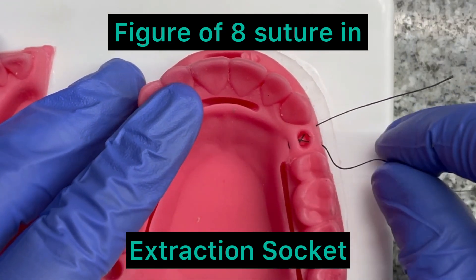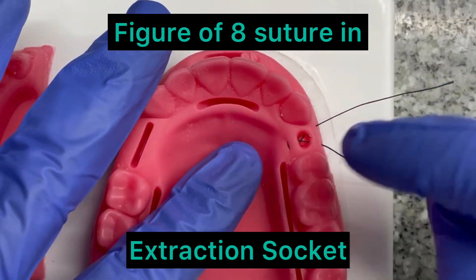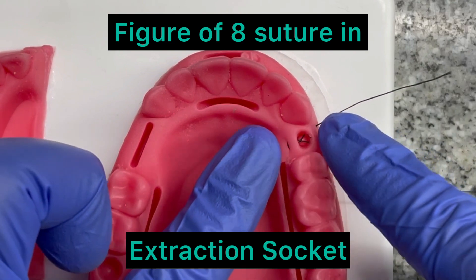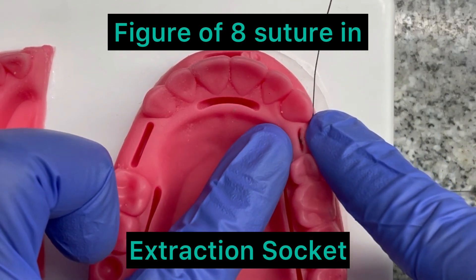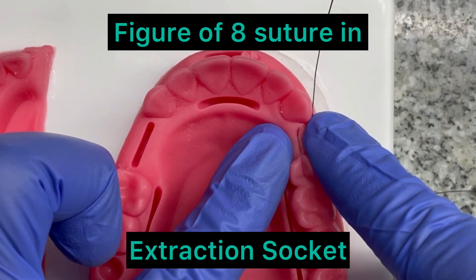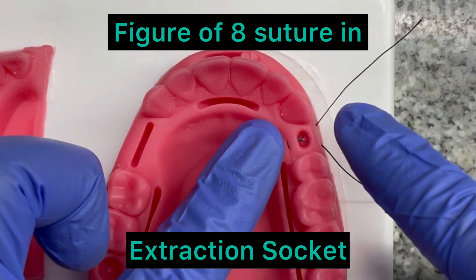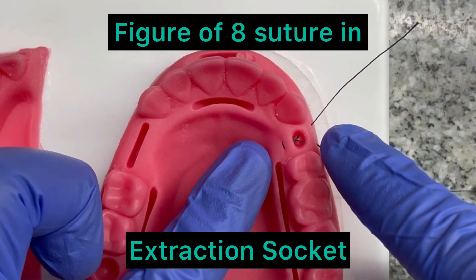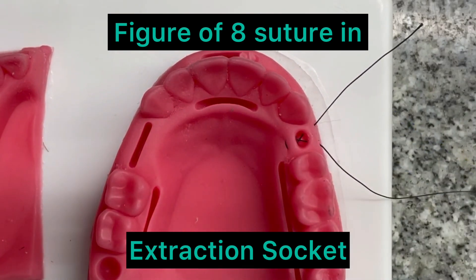This is number one entry, number two, number three, and the fourth exit point. The importance of the figure of eight suture is that it is not basically for closure of the wound. In an extraction socket, this suture is for the protection of the clot, because if the patient loses the clot, there will be high chances of dry socket.